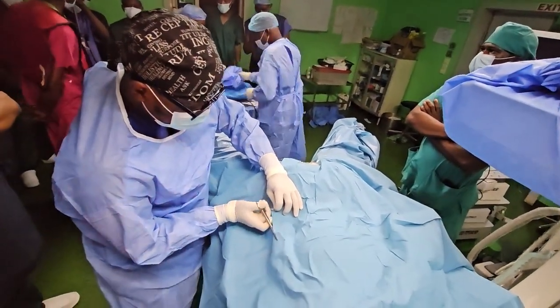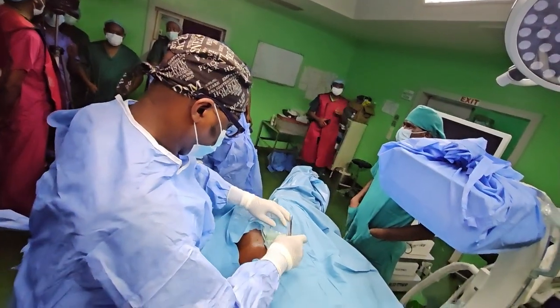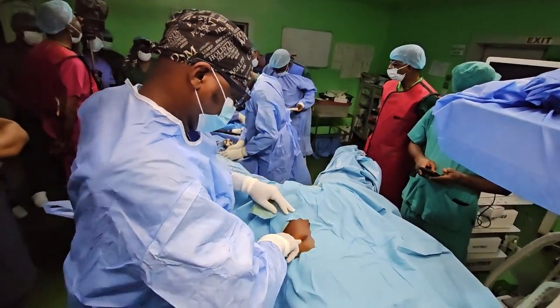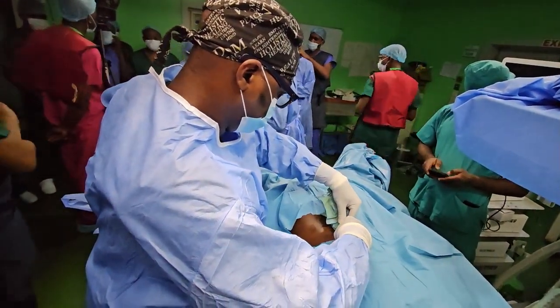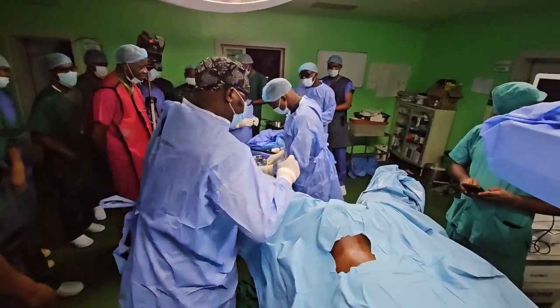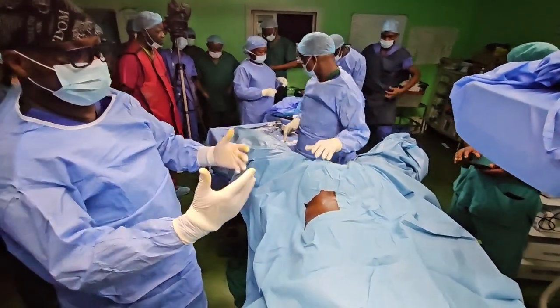Now, while we are waiting for the next step, can one of the younger consultants please Google patient positioning in PCNL? Patient positioning in prone PCNL, and share the images they see on the WhatsApp forum for this meeting. One of the younger consultants, so please Google patient positioning in prone PCNL. Well, they know themselves. You are one of the younger ones. So we can get another one. So we are getting the fluoro in.